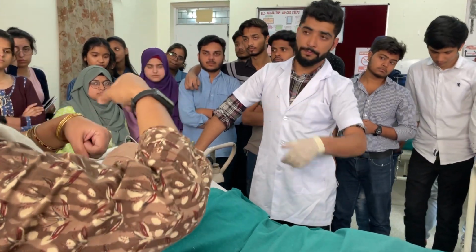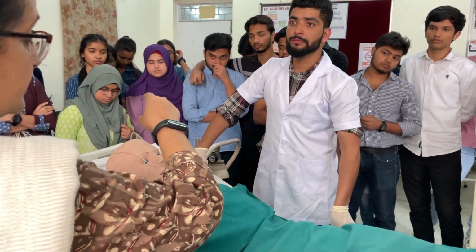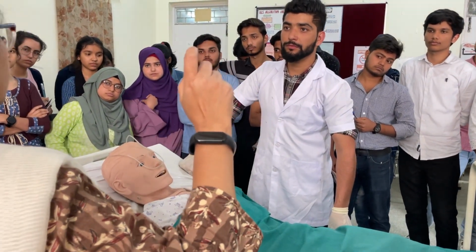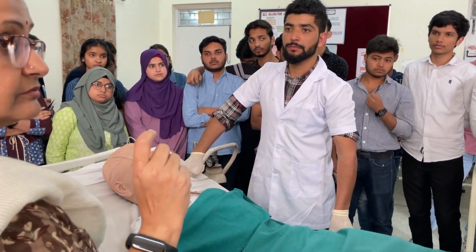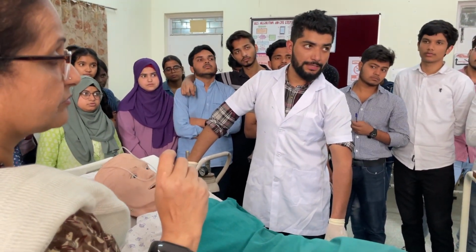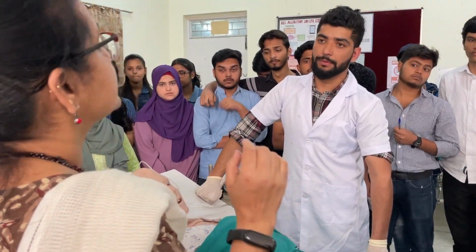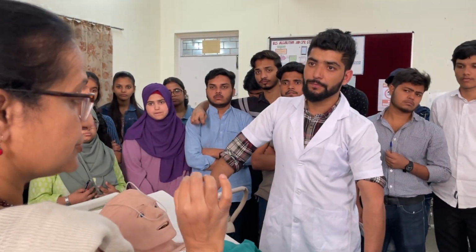Then check the cannula, how the oxygen is coming, and regulation flow meter also you have to adjust. How much you have to adjust? 1 to 4 liters per minute. We have to adjust to oxygen concentration. Certain patients will require less, and certain will require more. So most of the time doctors will write. Okay, so that also you have to find out.